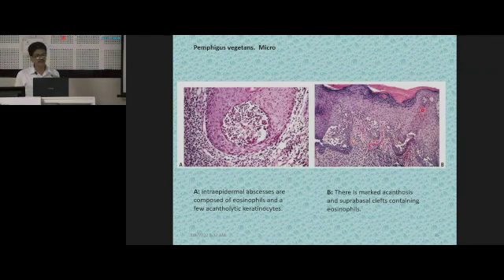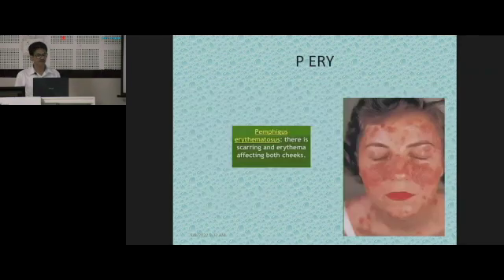In this case, you can appreciate the hyperplasia, right? So many layers are formed, and then keratin is also formed at the top, and a suprabasal cleft is seen over here. The healing stage of pemphigus vegetans. Next we come to pemphigus erythematosus. This has an overlap with SLE, pemphigus plus SLE. You can see here the typical butterfly rash, and in addition the lesions of pemphigus vulgaris.